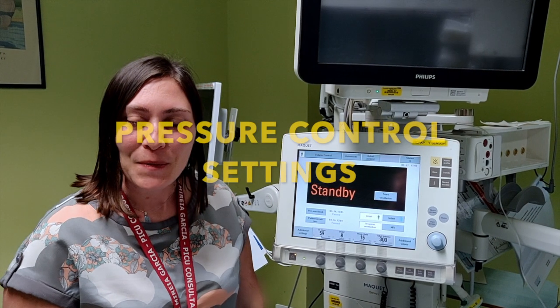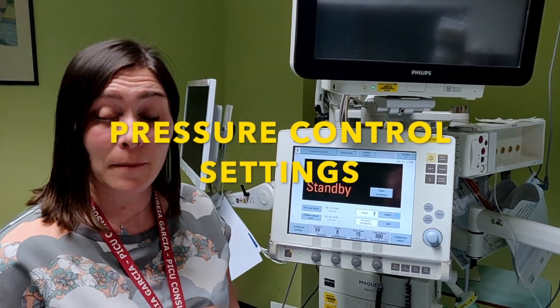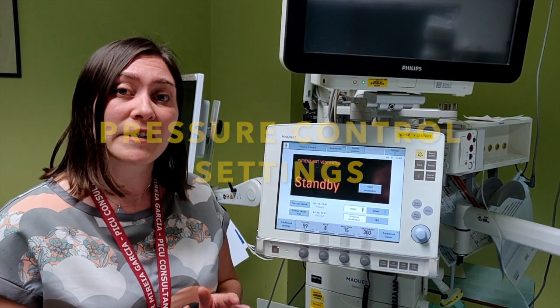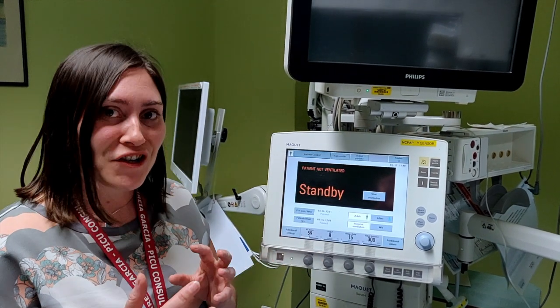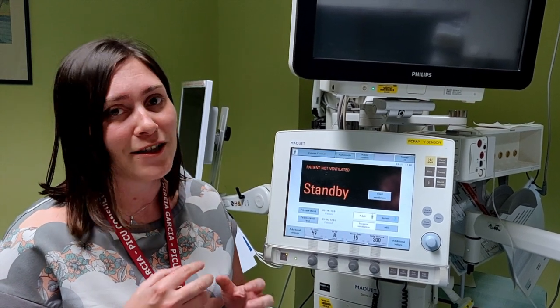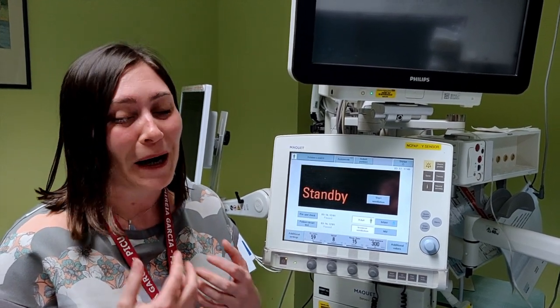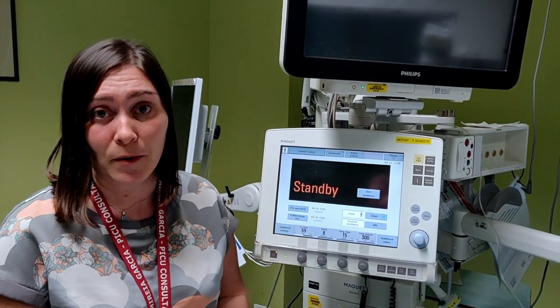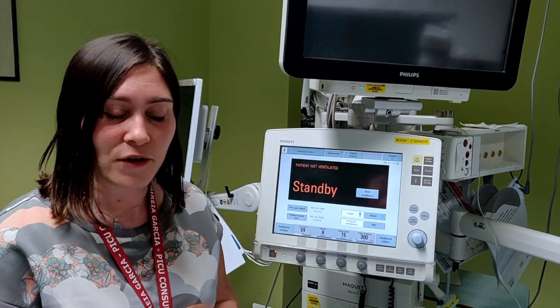So welcome again. We are now going to discuss the basic settings for pressure control ventilation. There is a lot of controversy whether volume or pressure is best, particularly with these patients in ARDS. The reality is that there is not much evidence to decide one or the other. I have my personal preference, which is volume, but you can definitely ventilate per pressure as long as you know the problems that you can encounter.